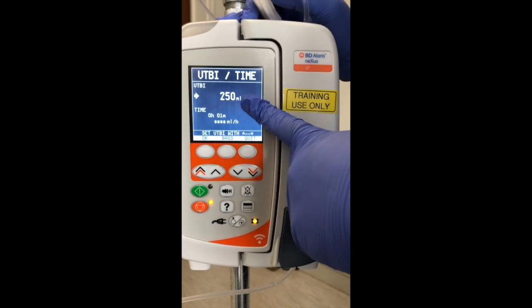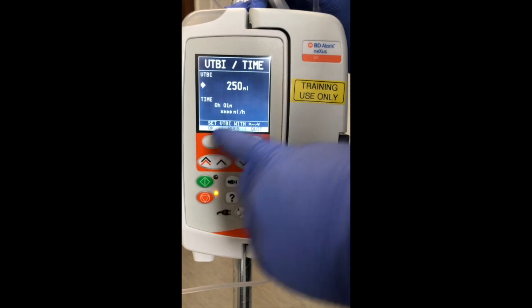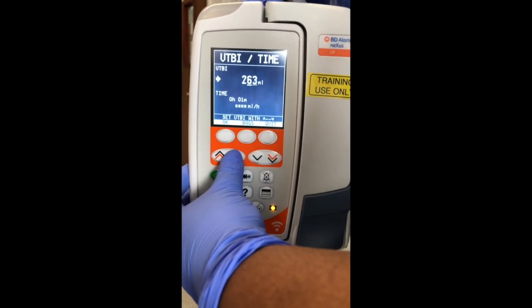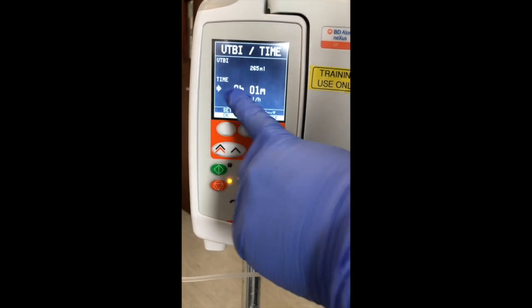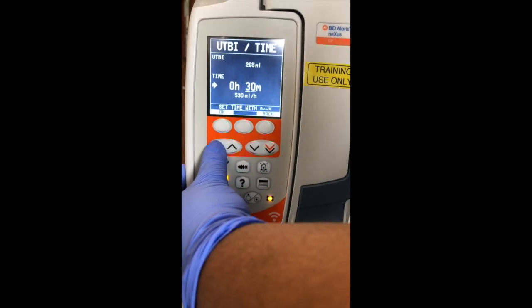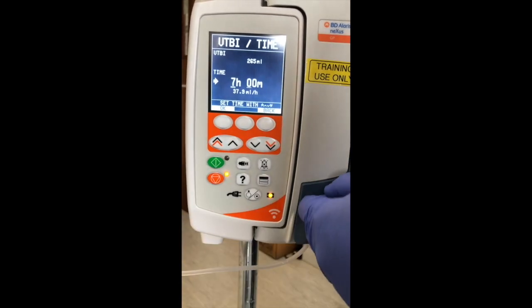And if I'm giving blood or any other medication added to it, I can use my chevron keys up again to add a specific volume. Okay. And then now to put in the time, you use your chevron keys to get to the time that's being prescribed.